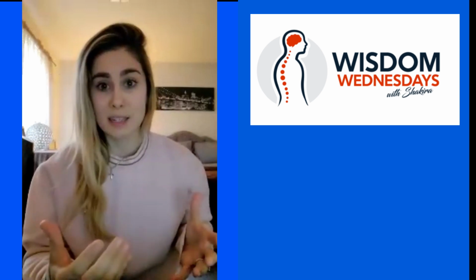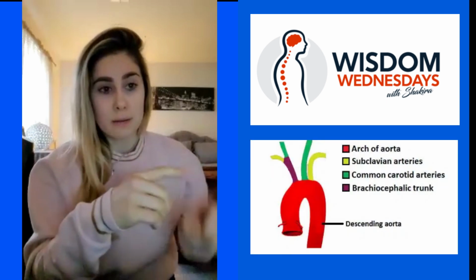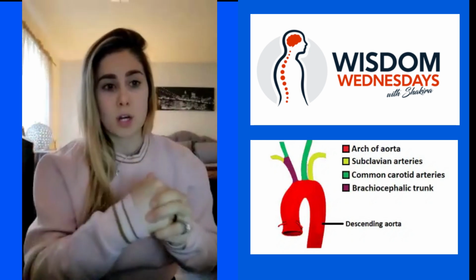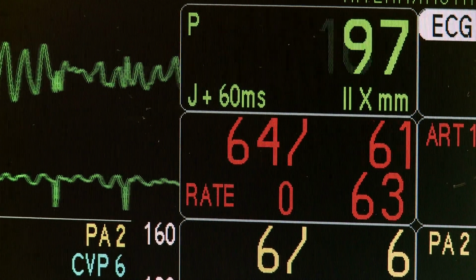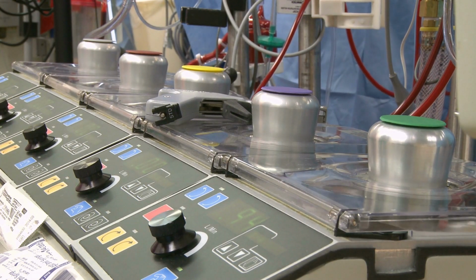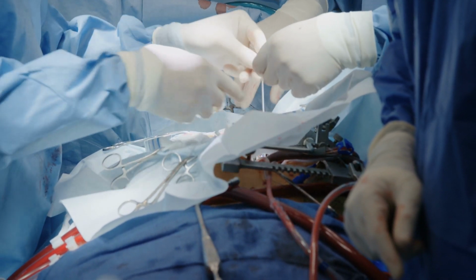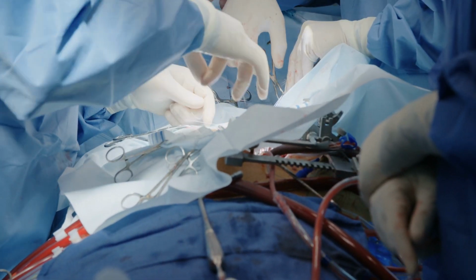Why would we do that during an ascending thoracic aortic aneurysm? If you look at the anatomy of what I just showed you before, in between any of those portions, the clamp can be placed proximally and distally so that the aneurysmal pouch could be removed and replaced with a graft. So when those clamps are on, if the clamps are above or below any of those eloquent structures, such as the subclavian or the common carotid, you might not have adequate perfusion. At that point, you would see a decline in your ulnars or maybe a flattening of your EEG, and then you would be able to alert the surgeon and perfuse for a moment and then reclamp while he does the procedure, or make some adjustments so that the procedure could be as safe as possible.